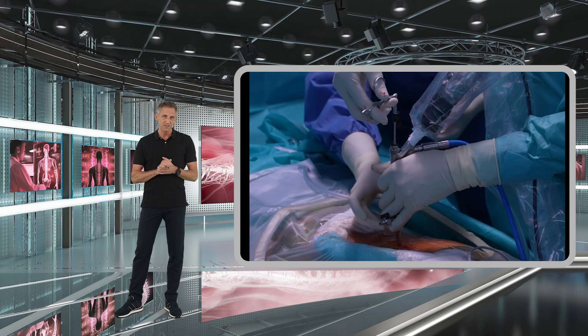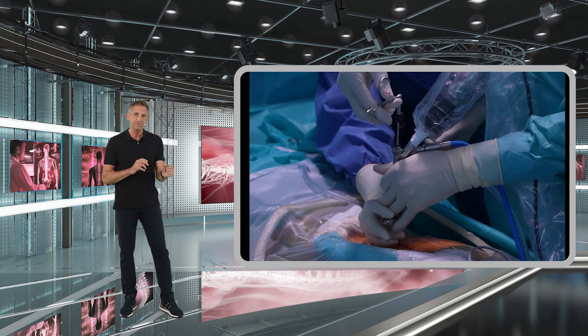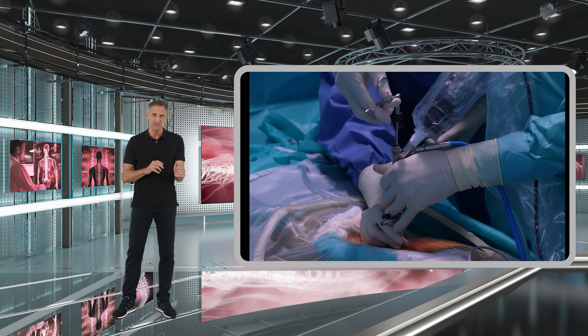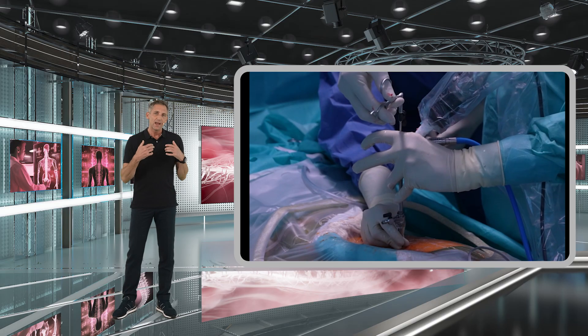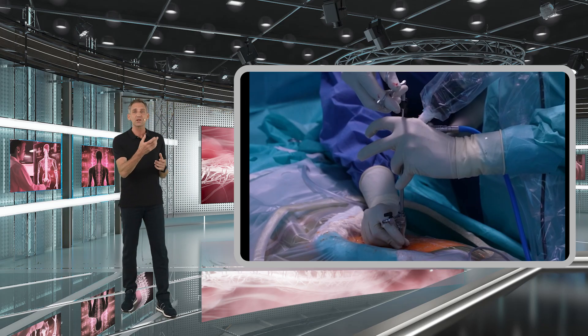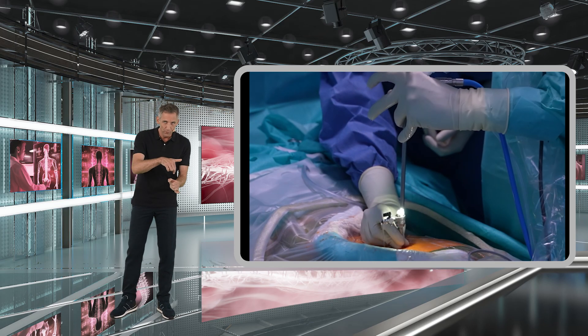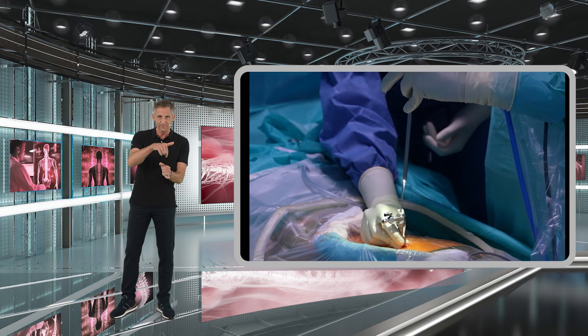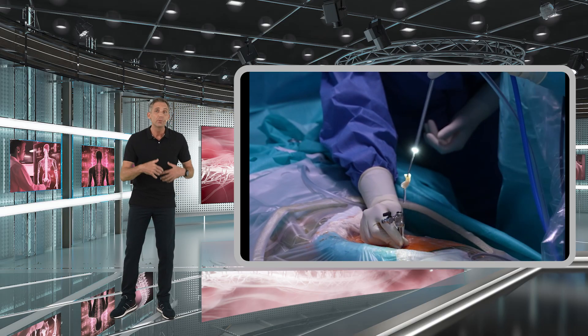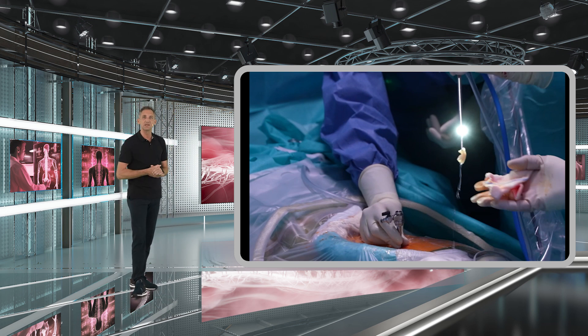In these cases, your assistant should fix the position of the working sleeve on the patient's skin surface. The inner diameter of the working sleeve is still much bigger than the working channel of the endoscope, so when you remove both the endoscope and the forceps together with the disc herniation, you will be able to remove much bigger fragments, as you can also see here.